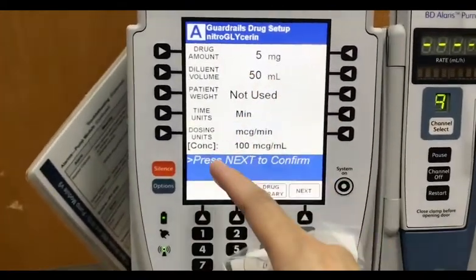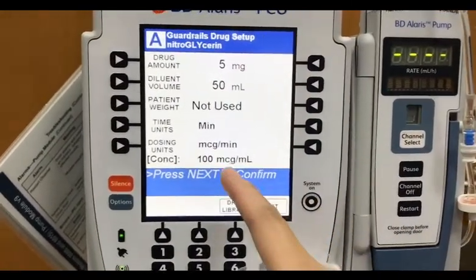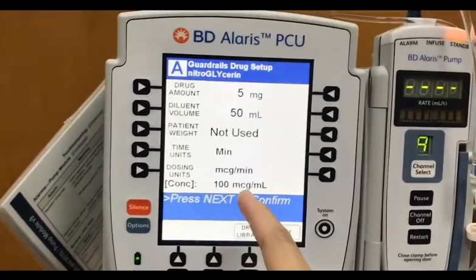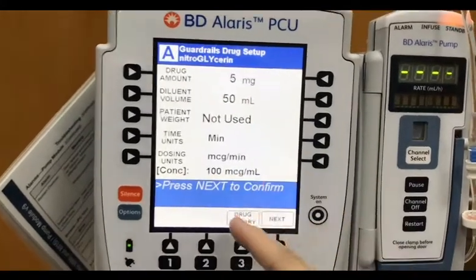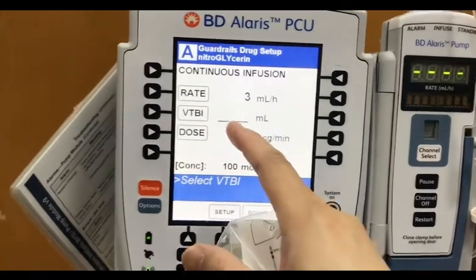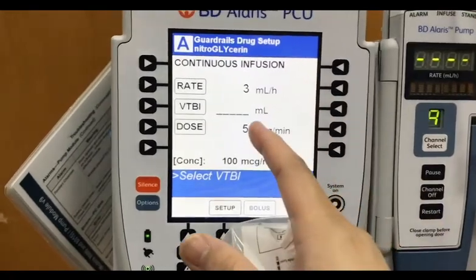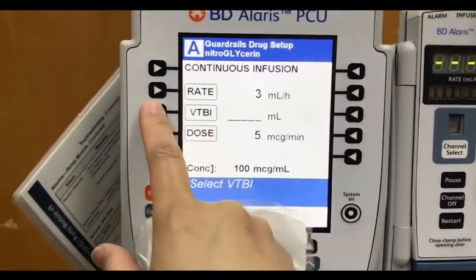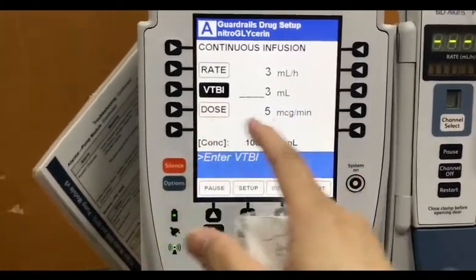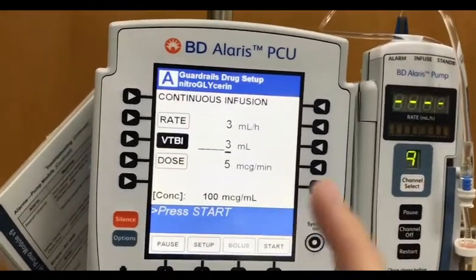So the amount of drug is 5 mg. It's automatic in the system. I am infusing 100 mcg/ml. This is the concentration of the medicine. So it is already calculated by the machine itself. Just press next. So 3 ml/hour, you are infusing 3 ml/hour. Volume to be infused, like for example, you want the 3 ml. So this is the 5 mcg/min. The machine has calculated it for you.